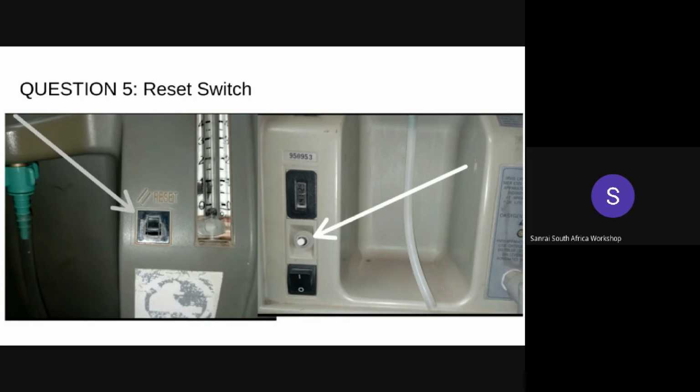Apart from tripping the reset switch, voltage sags also affect the lifespan of the motor in such a way that the motor windings overheat as more electric current is being drawn by the motor. This leads to the seals of the compressor to fail, and the compressor windings might eventually burn out.